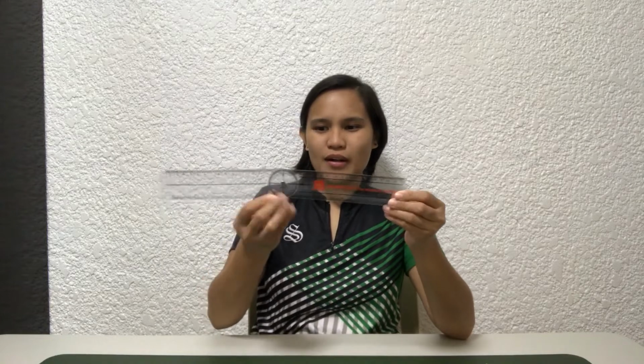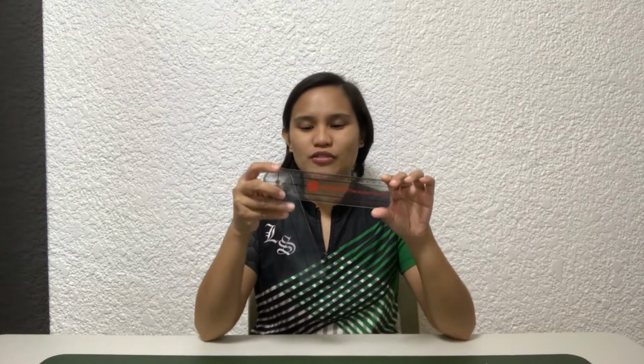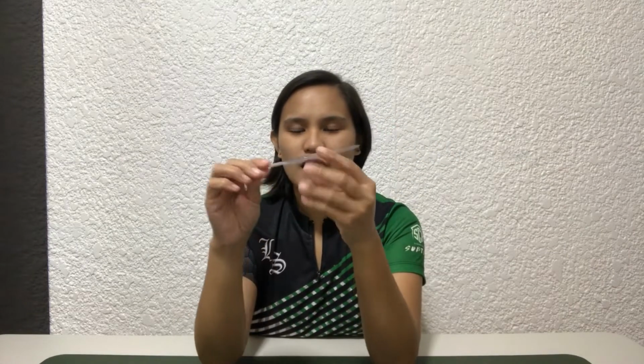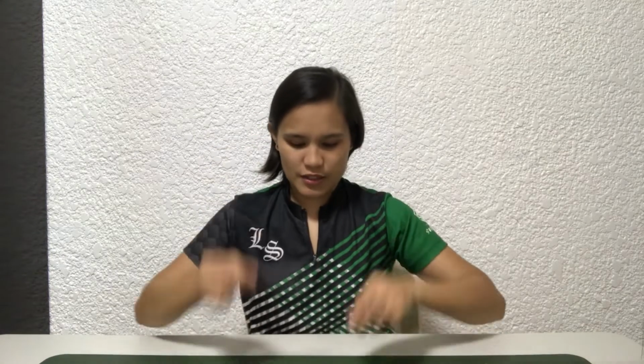So, for example, this is a large goniometer. We use this for larger joints of the body, for example, our wrist, elbow, shoulder, hip, neck, etc. And then, we also have a smaller version here. So, this one is a smaller version. We use it on smaller joints of the body, specifically the fingers, alright? So, we also measure the range of motion of the fingers, right?